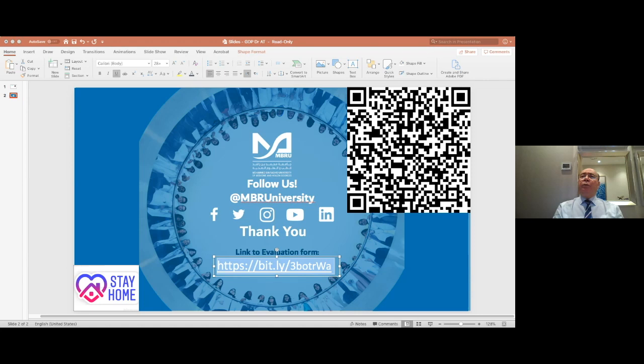No. Palatally, yes, it's possible. If you ask me palatally, if I have it, I will definitely use it. In the UK, we used to use CO2 laser. It is very good in cutting, with virtually no bleeding whatsoever. Someone was talking about bleeding before, and this is a very good way of doing it. And you have a very clean exposure. But again, you'll still have to cover the exposed area with some sort of protector like Coe-Pak or bone wax or something like that.